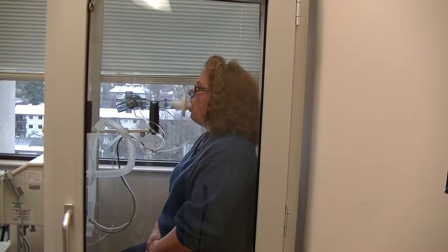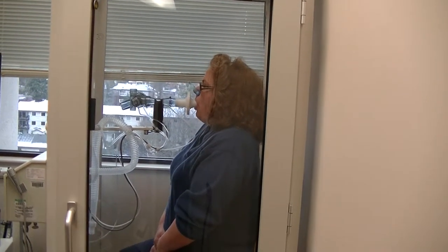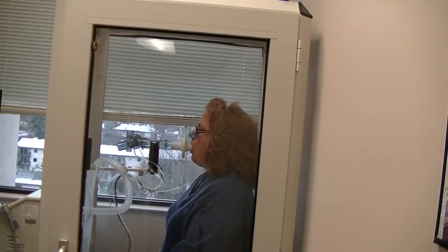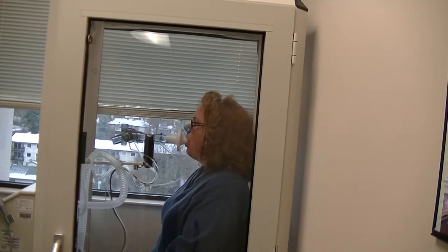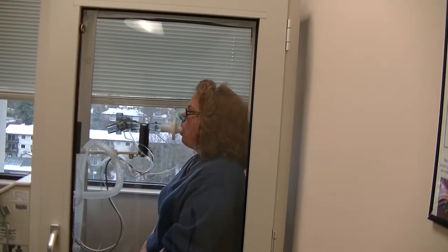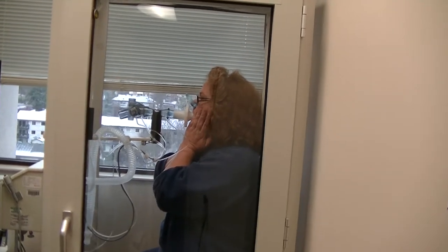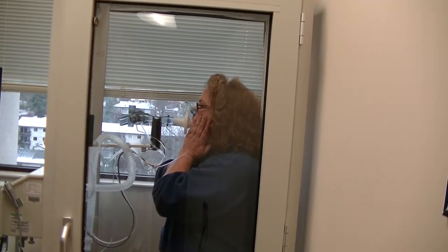Now all the way in, Terrell. And back down to normal breathing. Breathe in and out, normal breathing. Breathe in and out. This is where you're going to put your hands up to your cheeks. Now breathe in and out, normal breathing. Good. Breathe in and out.